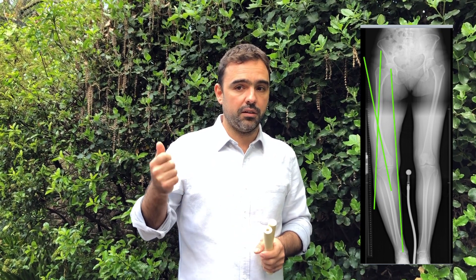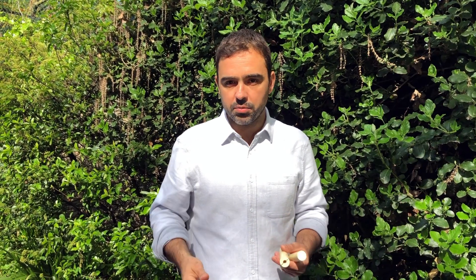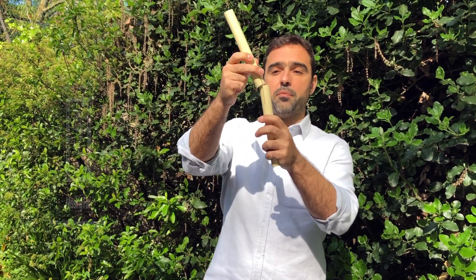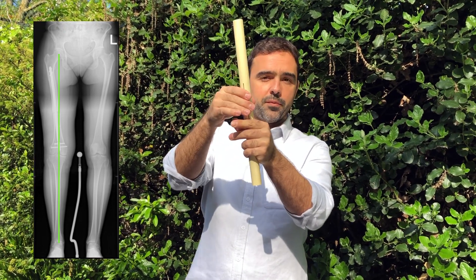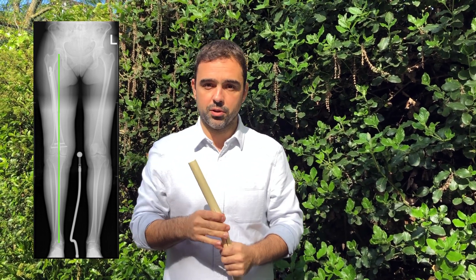Now we have to plan for treatment. In this case it's straightforward — it's a segment of bone that should be straight but is bent. So if we break the bone where it was broken before and put a straight device in it, we will end up with a correction. Straight bone, bent because of the fracture — we break it, put the rod back to normal, and you get the best possible outcome the easiest way possible.